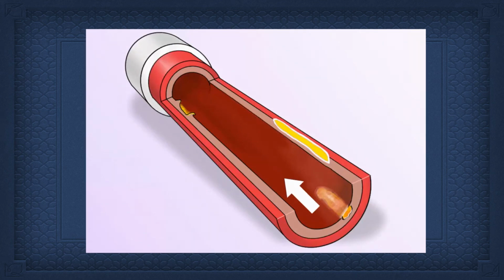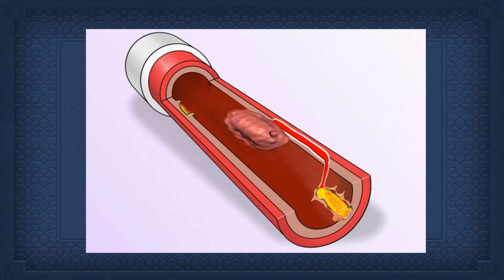But if we look at the video, actually I want to pause this video for 1 second. So what just ruptured on the bottom was a TCFA. But there's also a TCFA on the distal. You can see it if you look closely at the picture. And this was on the OCT images. That was not associated with a long necrotic core. This TCFA was. So when the TCFA was ruptured by the stent, it blew out a core greater than 6 millimeters long and evacuated it.